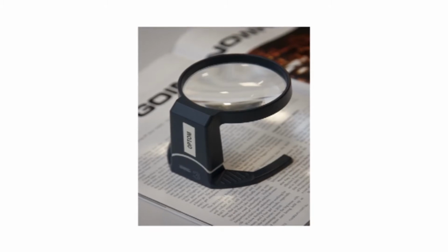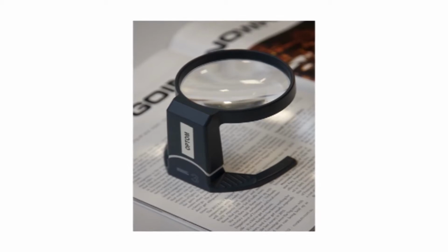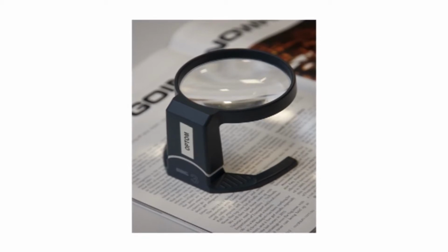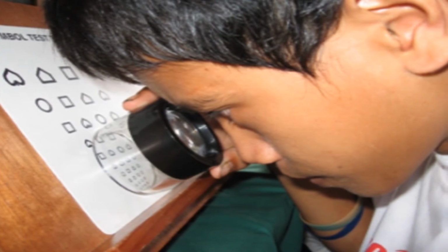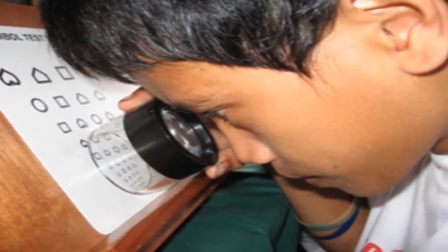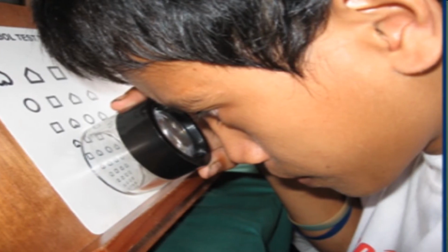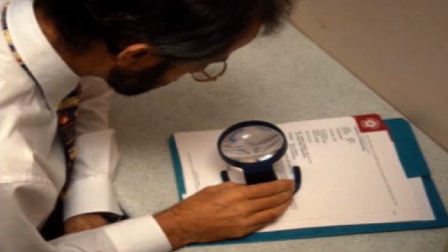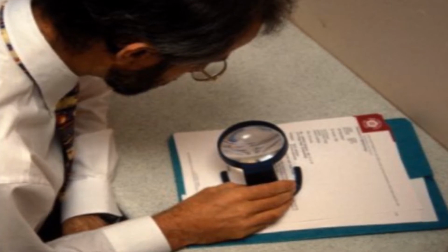Stand magnifier. The next optical device is the stand magnifier, where a high power lens is mounted on a strong plastic stand. It is useful for children as it has a fixed focal distance. Children with low vision will get comfortable posture if it is used along with a reading stand. This is useful to the person who has difficulty in finding or maintaining the correct distance.